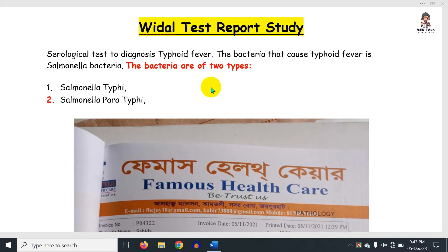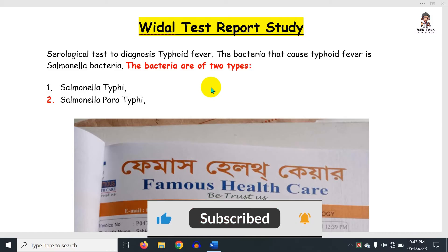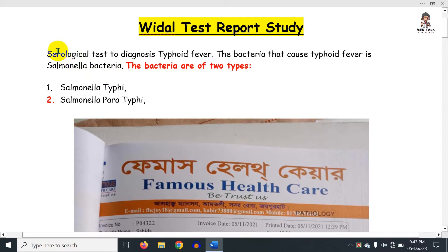We will be examining the Widal test report. This test is used for the diagnosis of the type of fever — specifically typhoid fever.